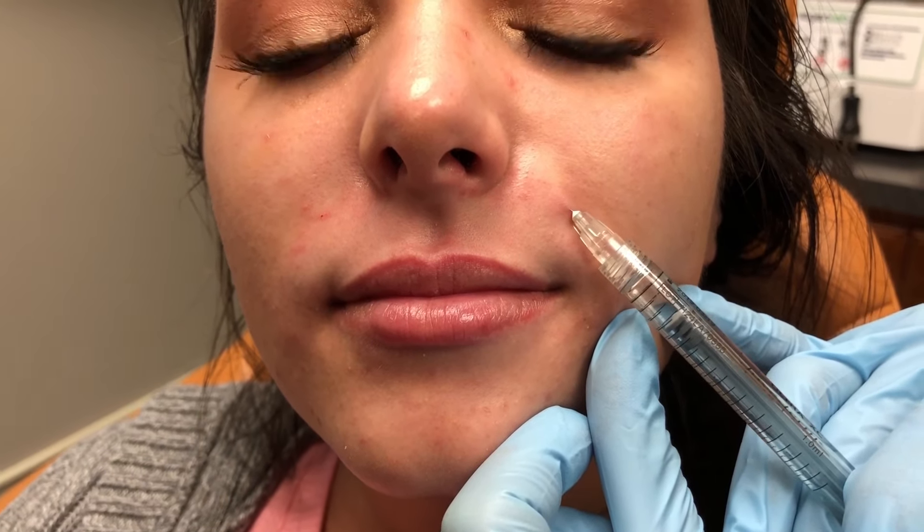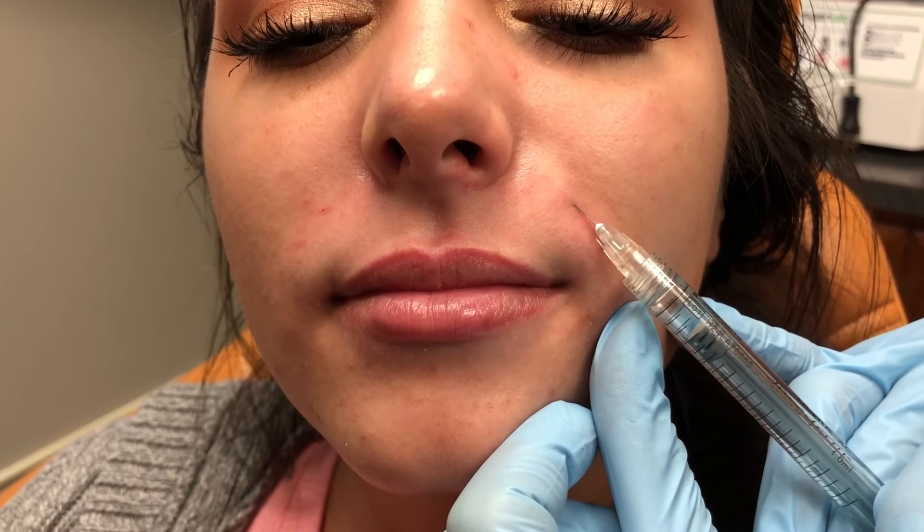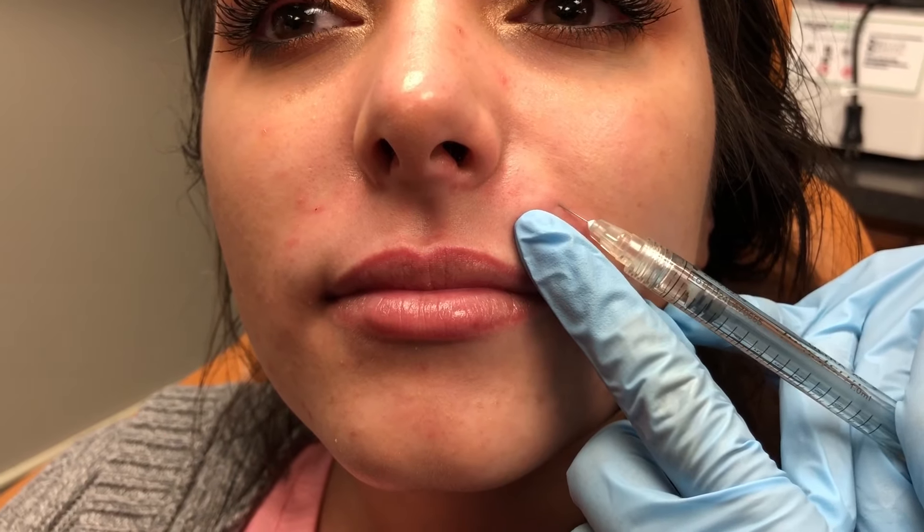I'm going to go back to the left side and add a little bit more. I'm going to go ahead and measure and give her a little more through here. Always tenting, always aspirating — you always want to make sure you're aspirating and tenting because you want to confirm you're in the right plane. Slow retrograde injection. Always want to make sure you're giving the best and safest injections to your patients. Fan over, tent up, always watching my syringe to know how much filler I have left and how much I'm putting in a certain place. You always want to know how much product you're using in a certain area — that's important for patient safety and also for your documentation. Go ahead and smile — all right, and relax.